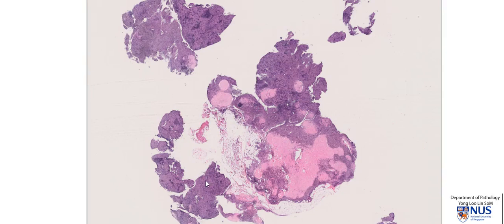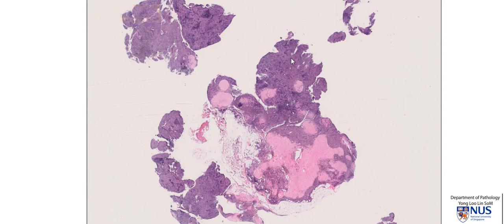Hello, this is a microscopic section taken from a hilar lymph node close to the lung. We don't actually see the nice oval shape of the lymph node or the capsule because it is somewhat fragmented. So these are the areas of lymph node parenchyma.